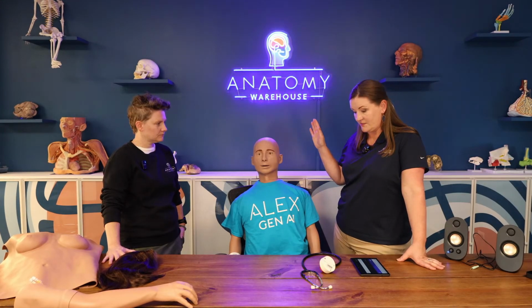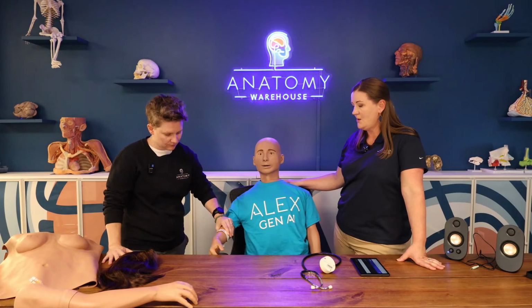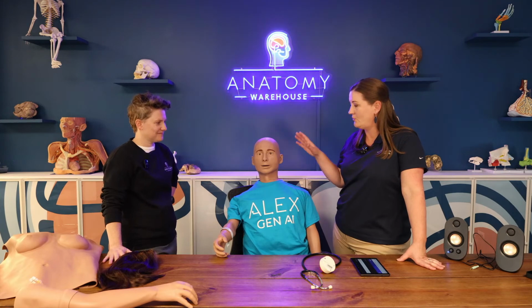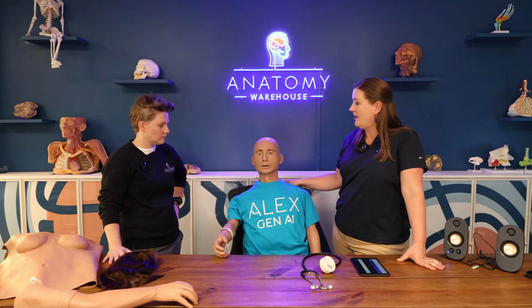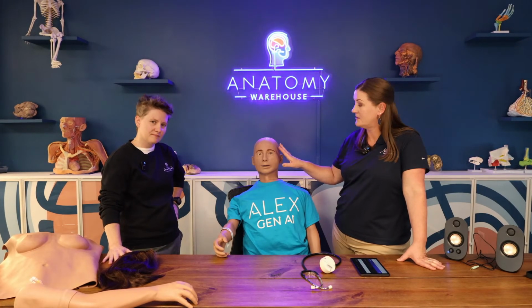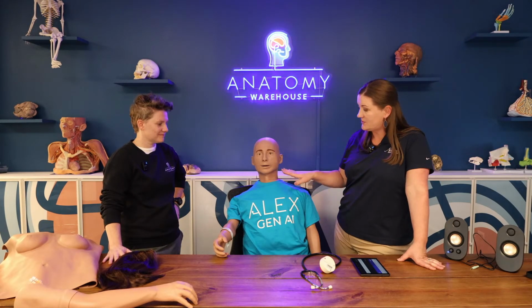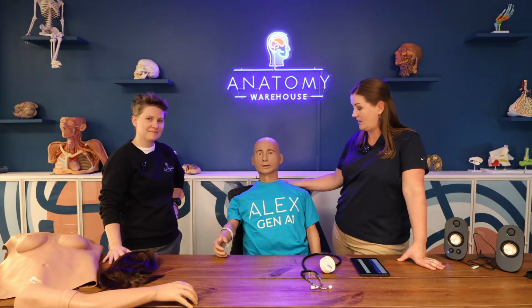Alex is a full body mannequin, and he has a lot of different features, from fully articulating arms and legs to pulse points throughout. He does have a fully intubatable airway. He has other features that are specific to the software and specific to Alex in the form of an iris camera in his right eye. He also has independent breathing and chest rise.